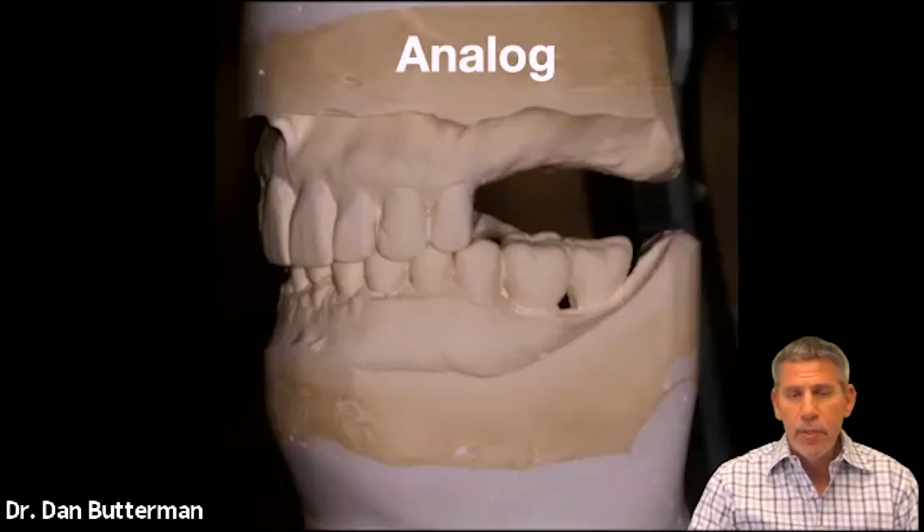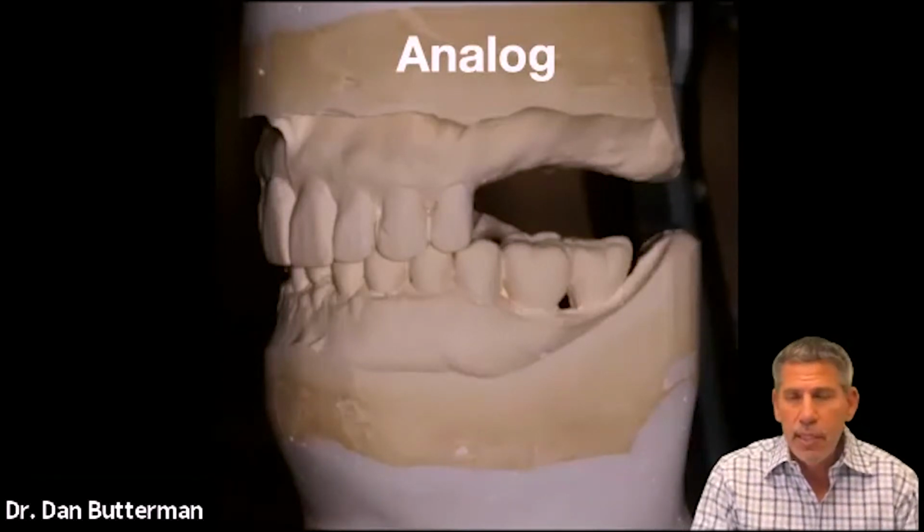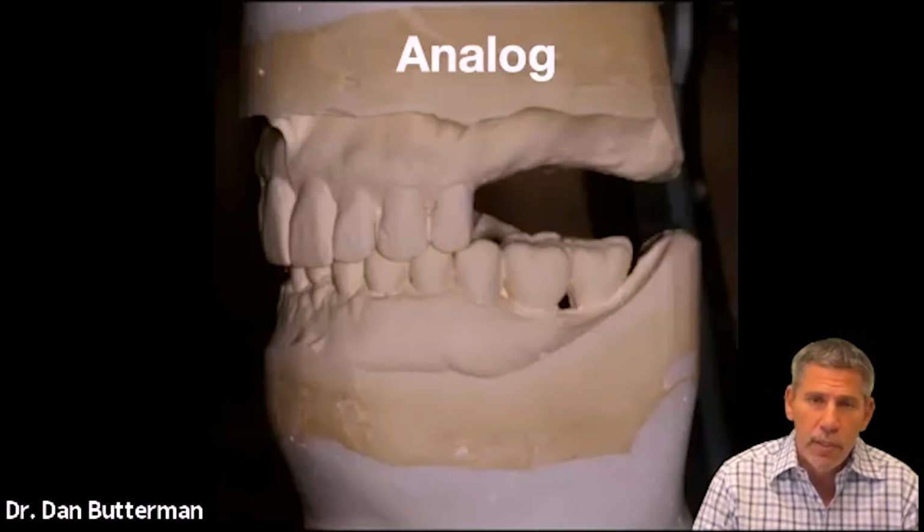Patient comes in and they're missing a couple of maybe posterior teeth. So you say, hey, Mrs. Jones, have you ever thought about replacing those teeth? And the patient's like, yeah, that would be great. What can we do? So what do you do? You do what you always do when you're not sure what you're going to do, and you take an impression.